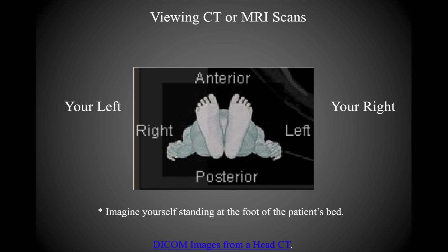Okay. So I also mentioned before that you can use contrast agents in CT just like with X-ray, and it's important to note that contrast agents are used in more than 50% of CT scans. But again, there are also many situations where contrast media is not going to be used for a CT scan. So just keep that in mind.